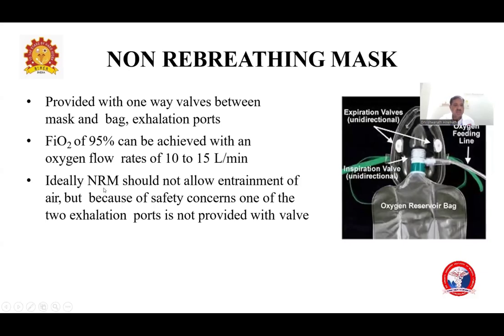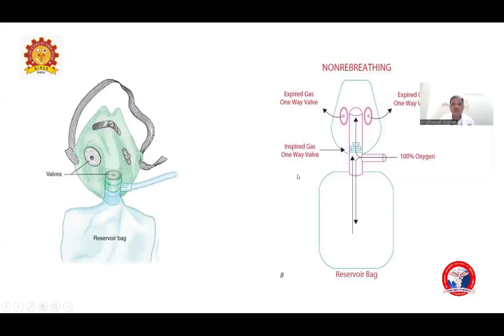Ideally, a non-rebreathing mask should not allow entrainment of air, but for safety purposes, one of the two exhalation ports is not provided with a valve. There is a one-way valve between the mask, bag, and exhalation port.